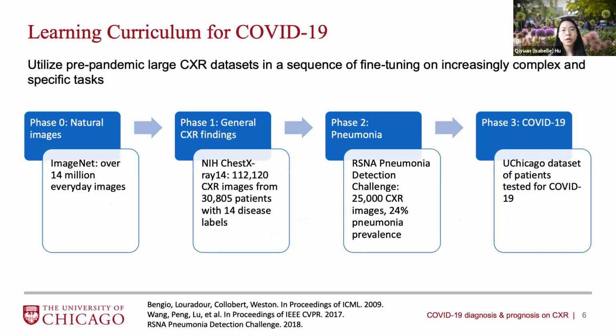We wanted to also take advantage of the large public CXR datasets established prior to the pandemic in our training. But we had the concern that pooling them together with our COVID dataset would introduce confounding variables that are not related to the underlying disease itself.